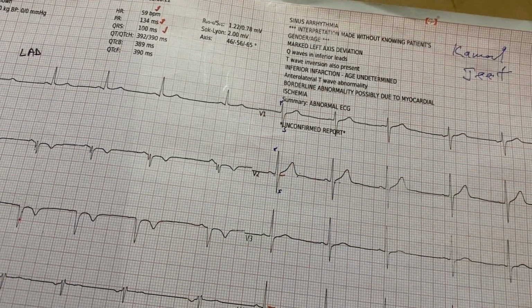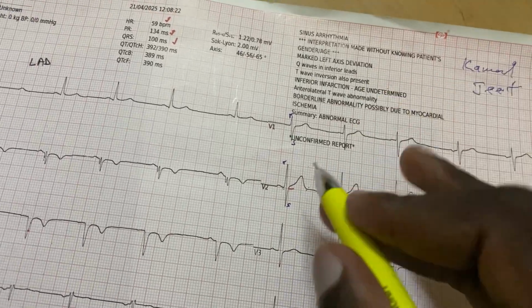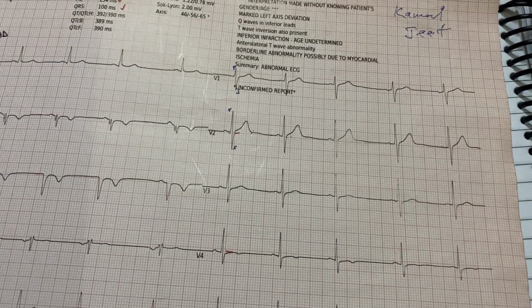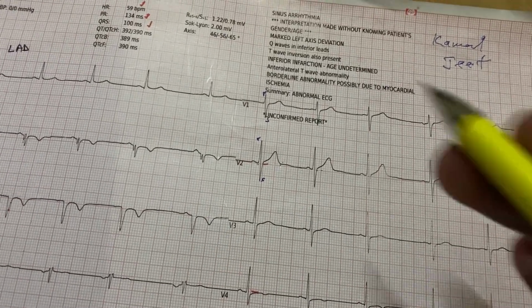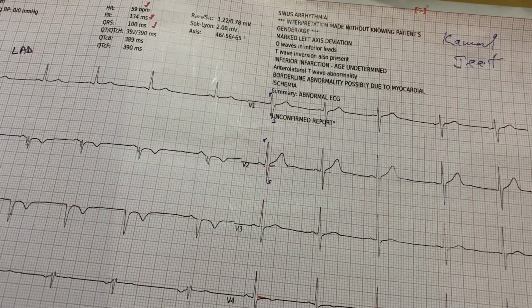We said also ventricular depolarization happens in three parts. First, septal depolarization, next depolarization of the free wall, and then the third one, depolarization of the basal parts of the ventricular free walls. The first part is septal depolarization, and then the second part, free walls.